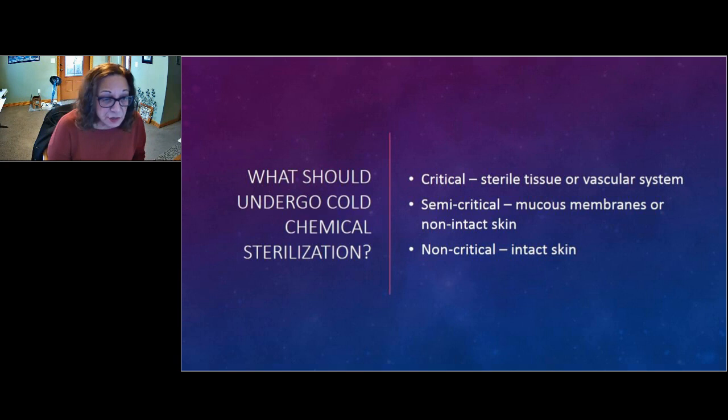The recommendation here from the CDC and, of course, Spalding classification is sterilization is preferable, but if for some reason the item cannot withstand the heat of sterilization or the sterilization processes, then high-level disinfection or cold chemical sterilization would be appropriate. And last, non-critical are items such as blood pressure cuffs that only contact intact skin. And as Peggy had mentioned, surface disinfectants are appropriate for that.